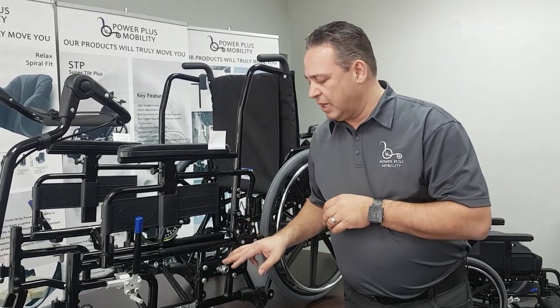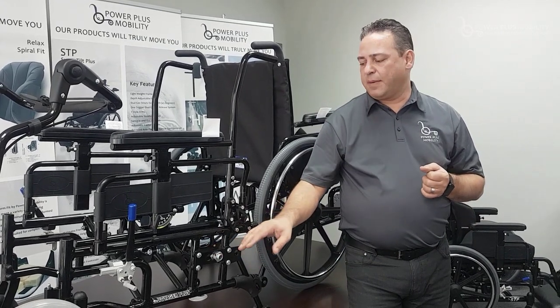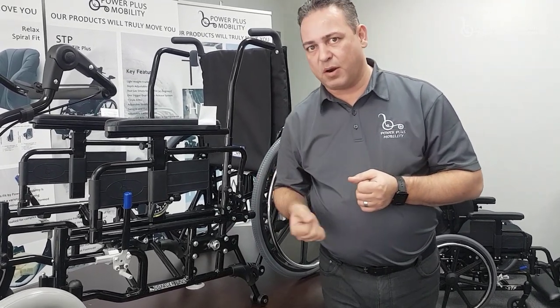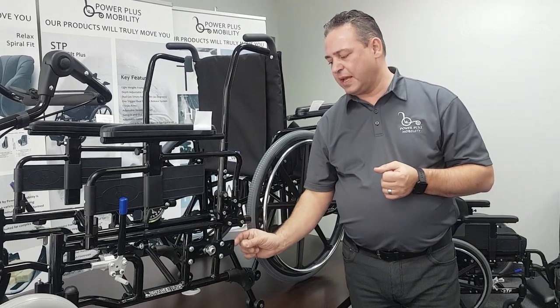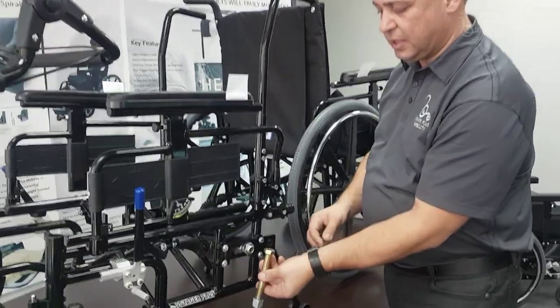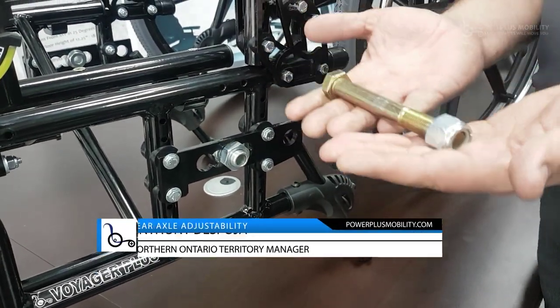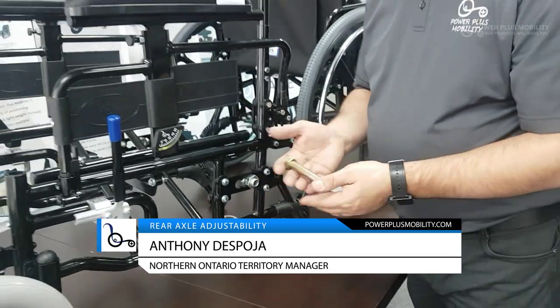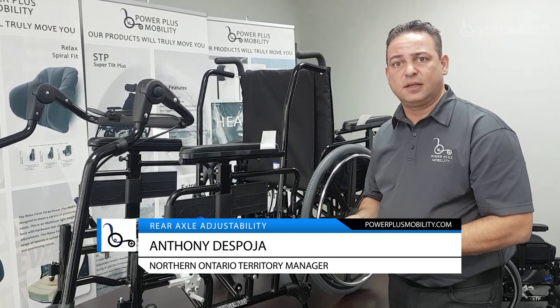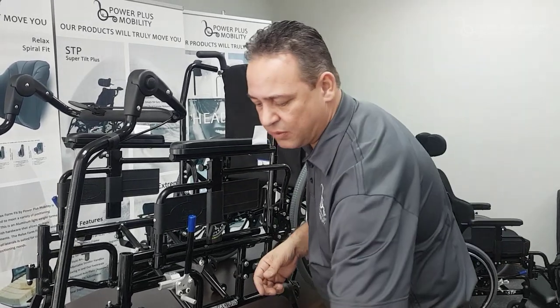We also have the option of beefing this up. For a client who is five or six hundred pounds, we can't put a standard axle plate on the chair because it will bend and warp. What we do at Power Plus is double up on the thickness of the axle plates and use a larger bolt to increase stability. This is what we call a bariatric bolt, part of the bariatric package of our rear axle assembly. If a client's conditions have changed, switch to a heavy-duty bolt in a bariatric application to prevent bending.